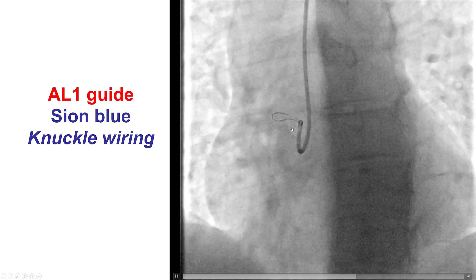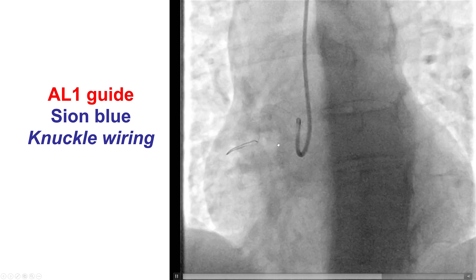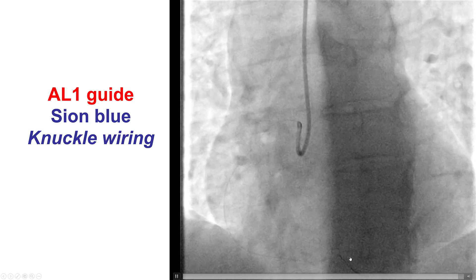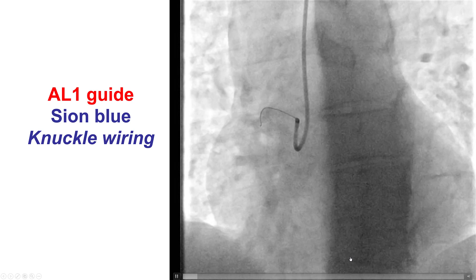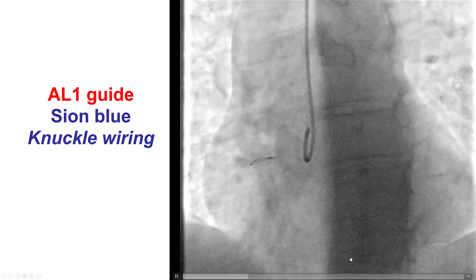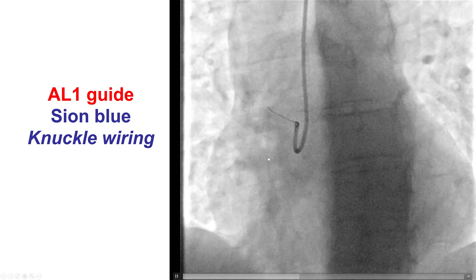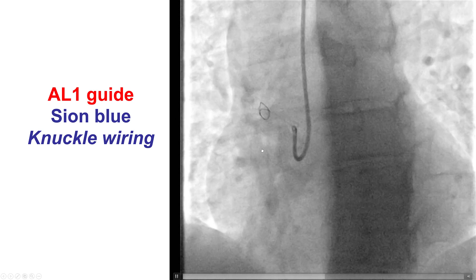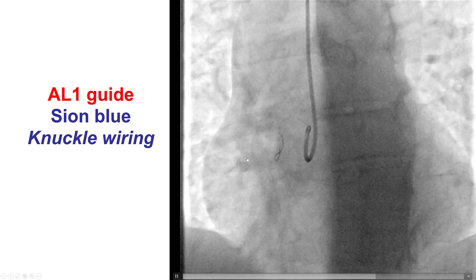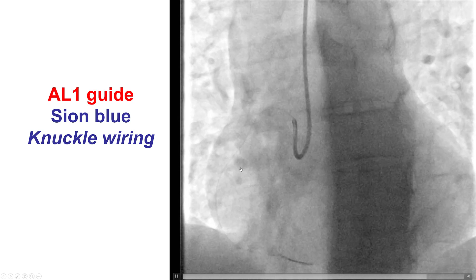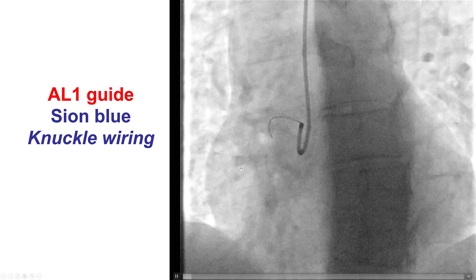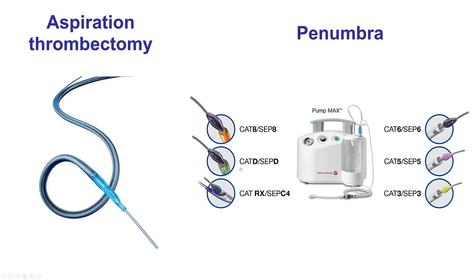After a couple of attempts, the loop nicely advanced distally. This can potentially decrease the risk of perforation. Also, the loop is more likely to follow the natural curvature of the vessel versus selecting a side branch and causing a potential perforation.